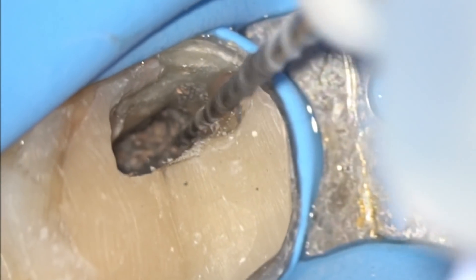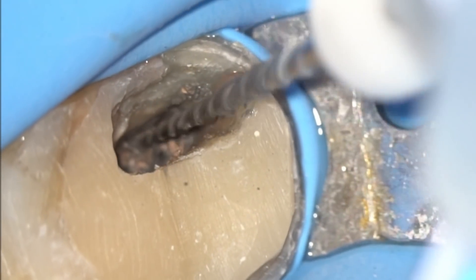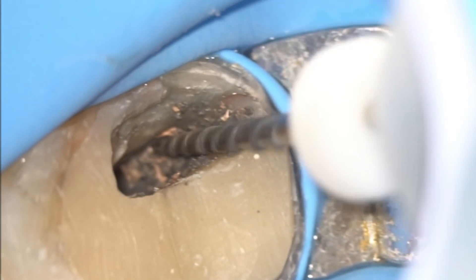Once the ultrasonic files have created a space or initial glide path, the second step is to use the re-treatment files. These files are going to remove the maximum chunk of Gutta Percha from the canal. They have a fluted design by which all the Gutta Percha, debris, and sealer debris is extruded out of the canal, and none of the debris gets pushed beyond the apical foramen.